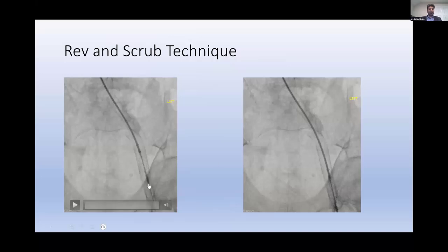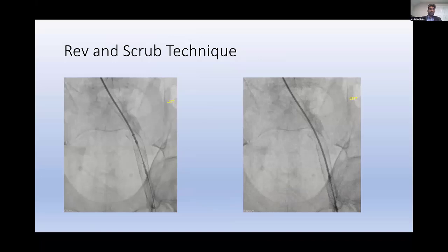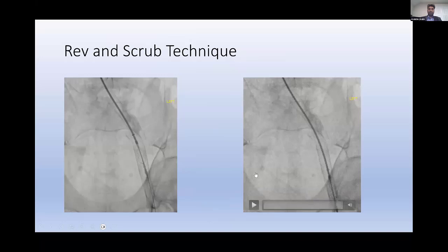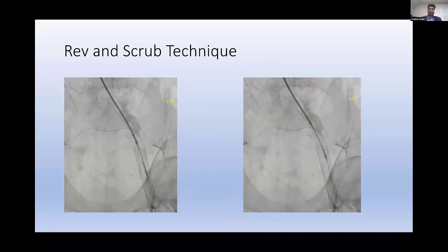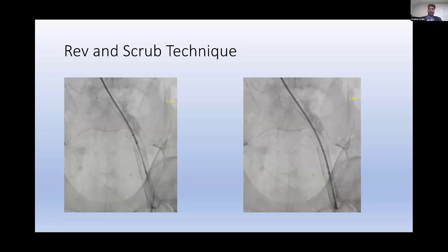The rev-and-scrub technique: revving is like revving a motorcycle — you move the device a millimeter or two as you do it. The scrubbing technique involves opening it up to a certain size and making passes at about one to two millimeters per second. Most of the cheese-grating effect that was described happens when you're scrubbing.